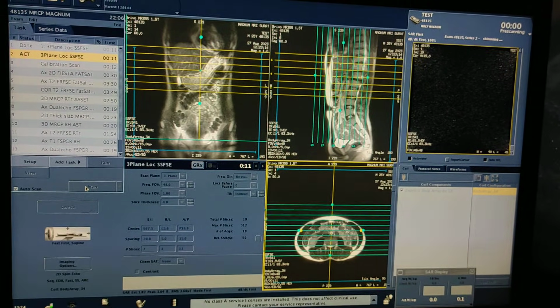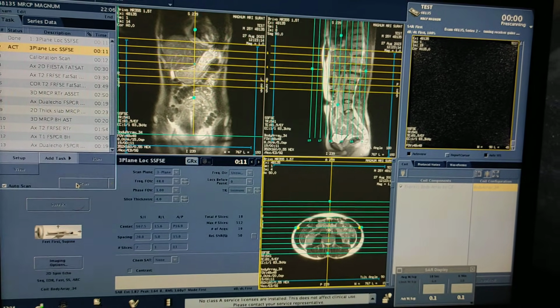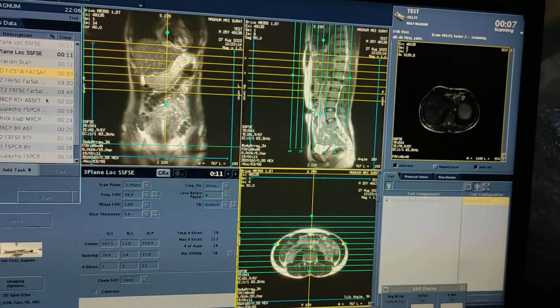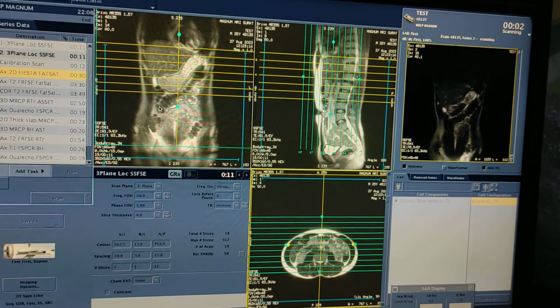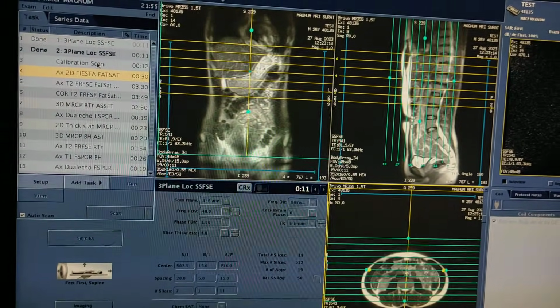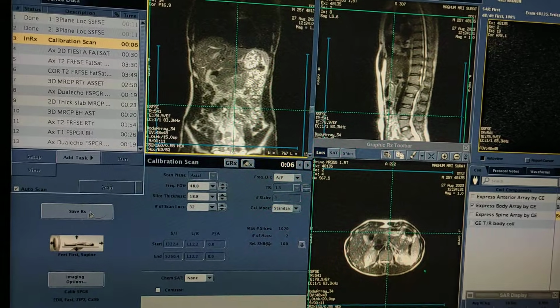After getting the tri-plane localizer, for better planning we have to run a 2D FIESTA. This is a fast sequence. We will get this sequence in only 10 to 20 seconds. So for better positioning and better planning, we run the tri-plane localizer, and after that we will run a 2D FIESTA. Now we have to calibrate this second localizer, body array 3-4.